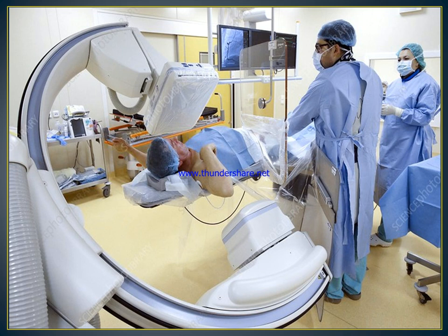This is the angiographic room, and you can see this is a C-arm machine and the patient lying on a patient couch, and this is the image display system, and the procedure is going on. So this is an angiographic room with the angiographic team which does the angiography.